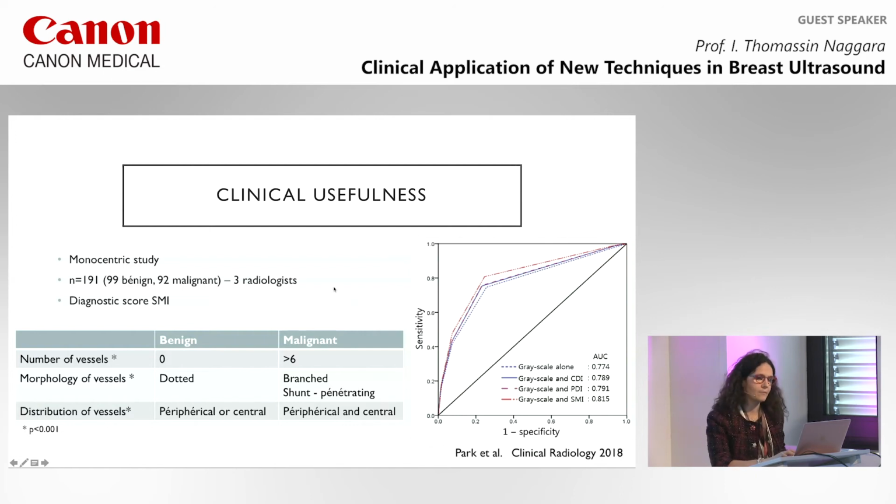So it's a preliminary work because you have a high prevalence of malignancy in comparison with your clinical practice. So that must be confirmed, but I think it's a good first step for this new technique.